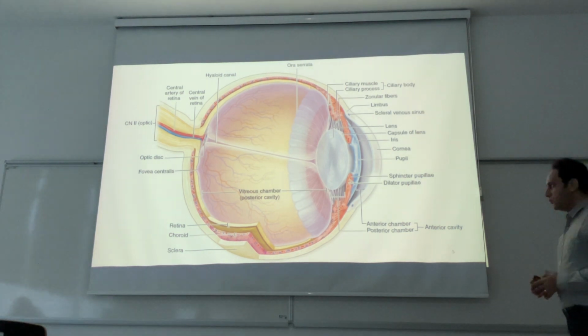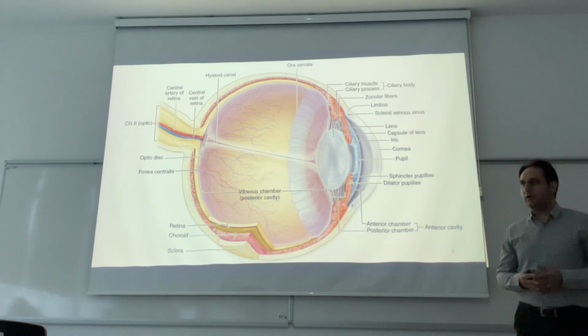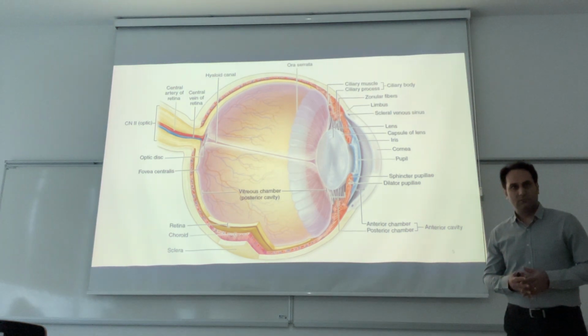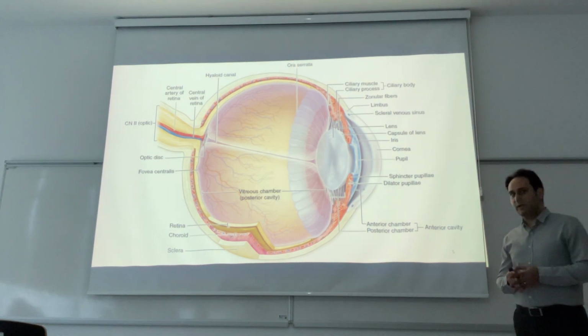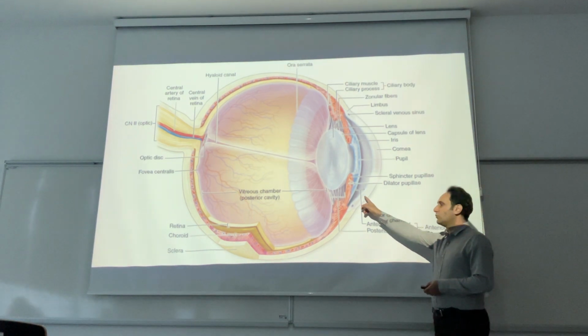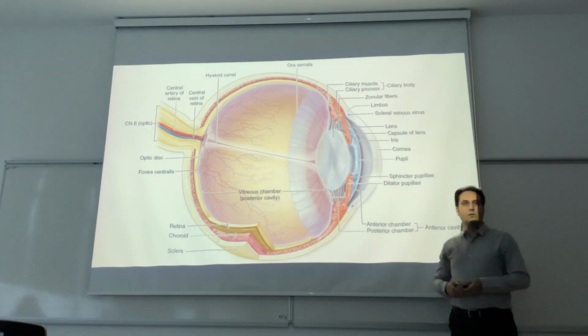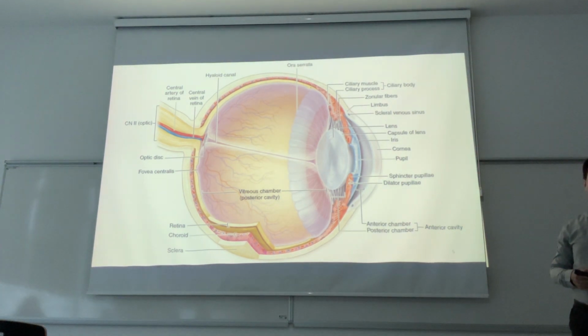As you know, normal connective tissues have a high amount of blood vessels. These blood vessels can give nutrients to the connective tissue. But in the connective tissue or stroma of the cornea, we can't find blood vessels. Why?